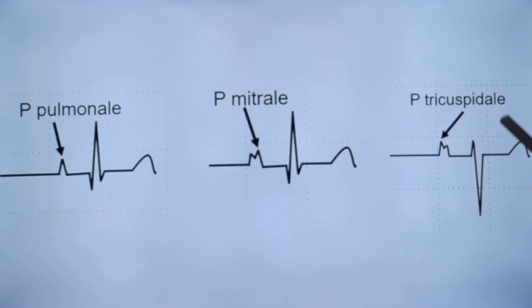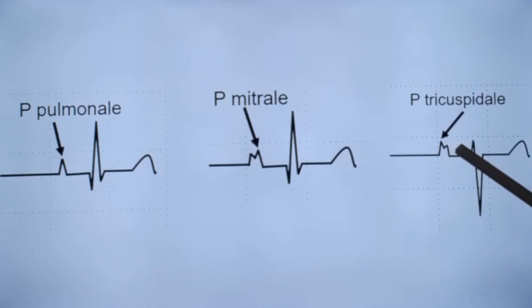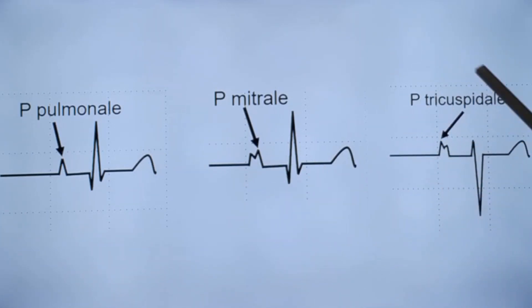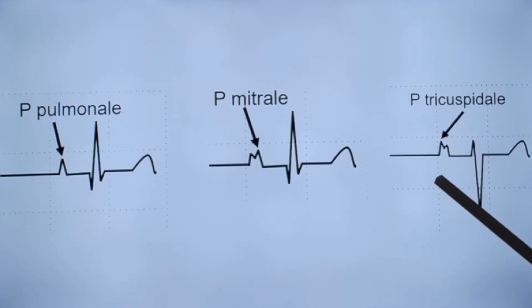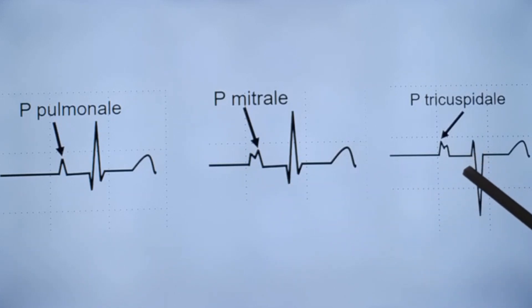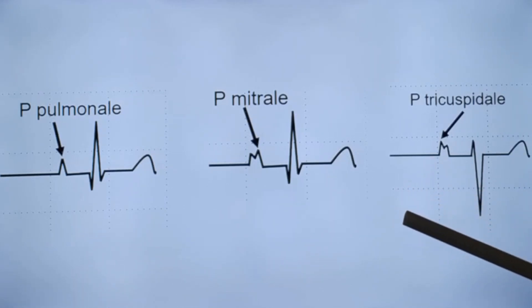P tricuspidale is evidence of biatrial enlargement but is predominantly right atrial, as in tricuspid atresia — that is why the initial component is taller than the second component, making it a mirror image of P mitral. This is a rare finding; many clinicians are unlikely to ever see P tricuspidale on an ECG, so it is mainly of academic interest.